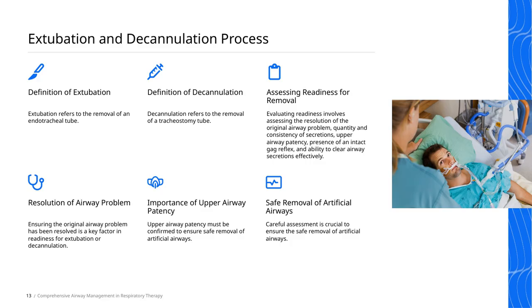Now, to clarify the terminology, decannulation refers specifically to the removal of a tracheostomy tube, while extubation, on the other hand, means removing an endotracheal tube.